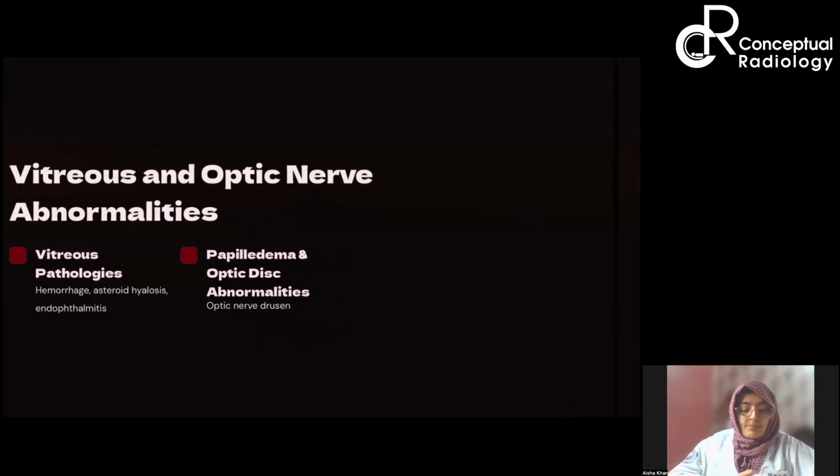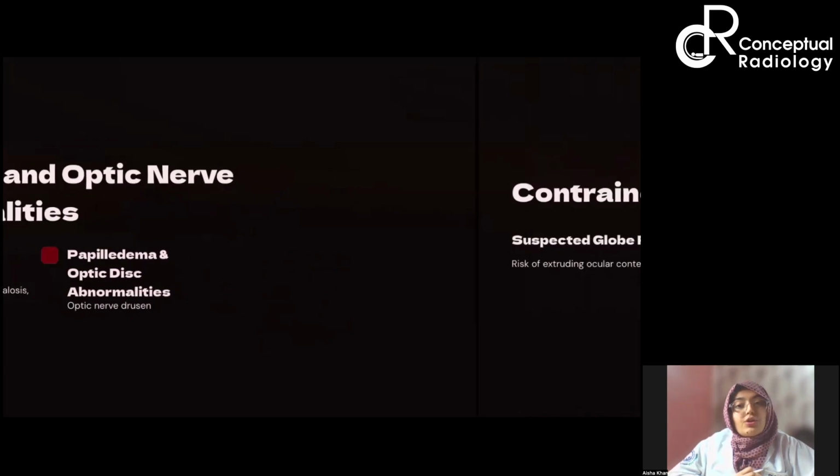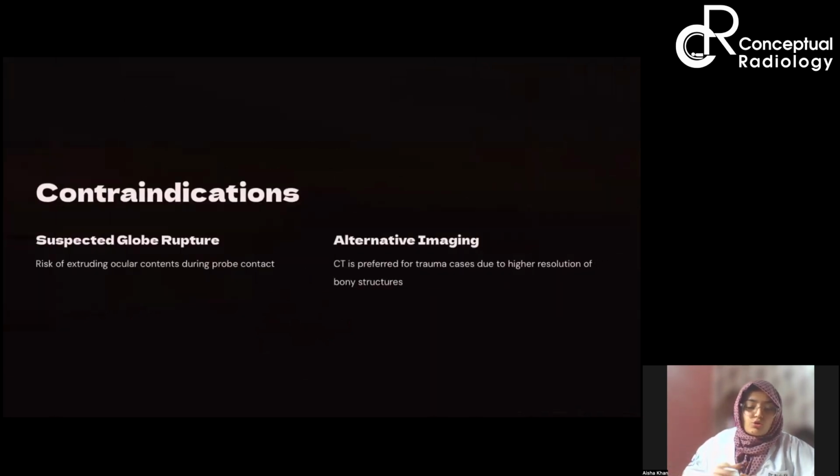ठीक है. Up next हमारा आ जाएगा what are the contraindications. So if I talk about, can you guys just tell me, चलो let's keep it a bit interactive, so we'll gain much more from this lecture. ठीक है. So can you tell me some contraindications in which patients you will refrain from doing a B scan ultrasound?